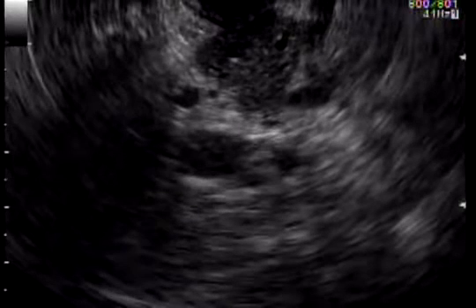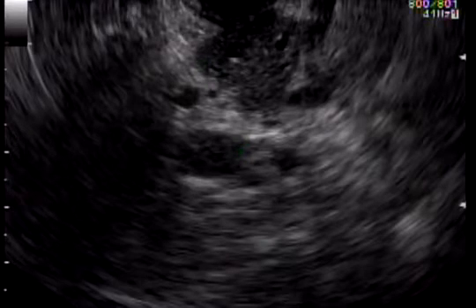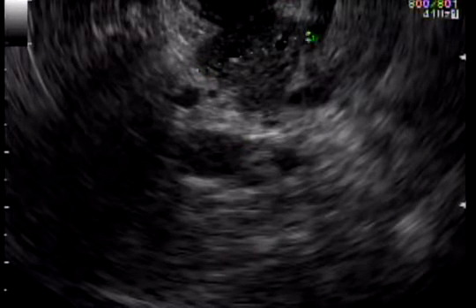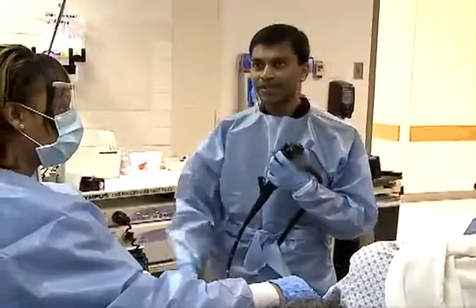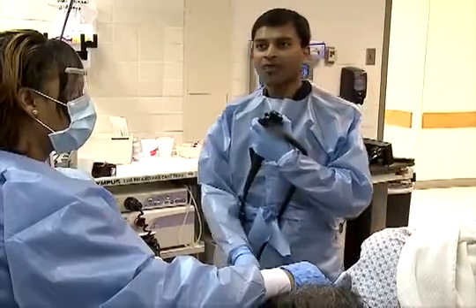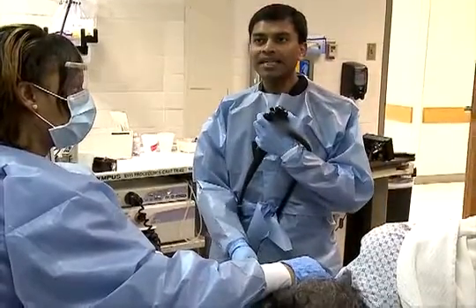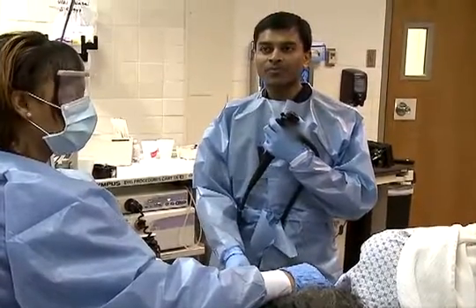And then I move my shoulder to the right, and I trace the pancreatic duct. And here, as I trace the pancreatic duct, I come into view of a structure that is a little indistinct from the rest of the pancreas. Now this lesion measures 2.17 by 1.7 centimeters. It's a little hypoechoic, and by looking at this EUS image, it is very hard for me to say whether this is a malignant or a benign lesion, and we have to procure tissue to make a definitive diagnosis.